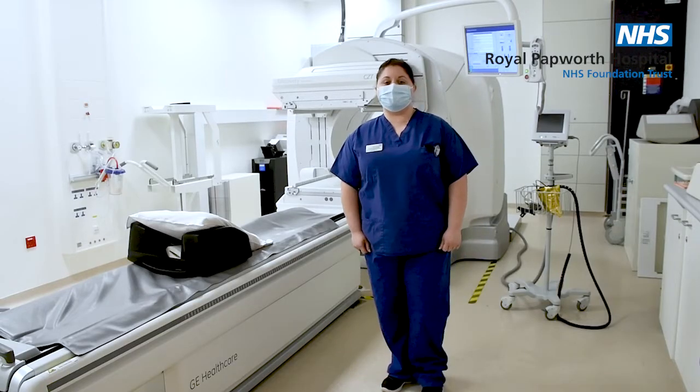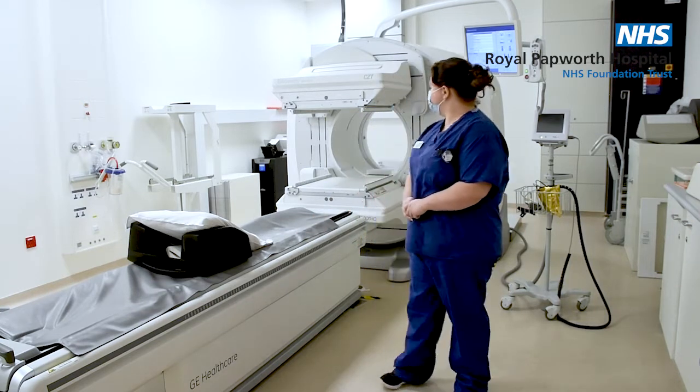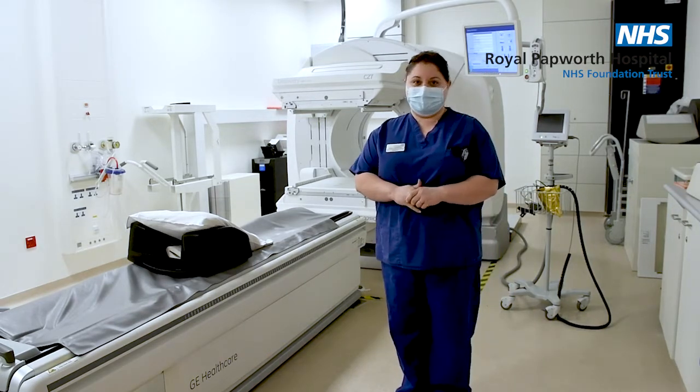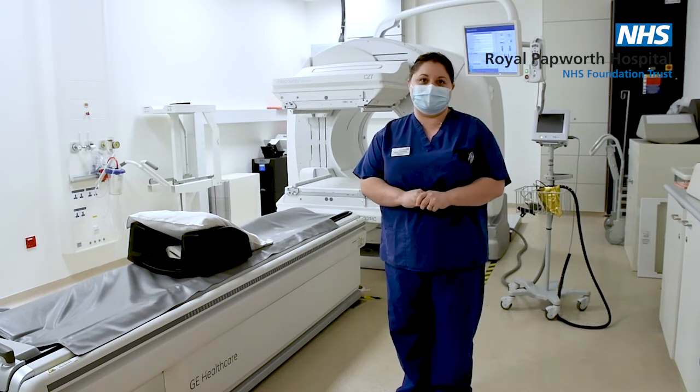Hi, my name is Katie. I'm one of the radiographers. Welcome to Nuclear Medicine. This is our hybrid SPECT-CT gamma camera and this is where we do mainly cardiac stress imaging to have a look at the blood flow to the heart muscle under stress and under resting conditions.